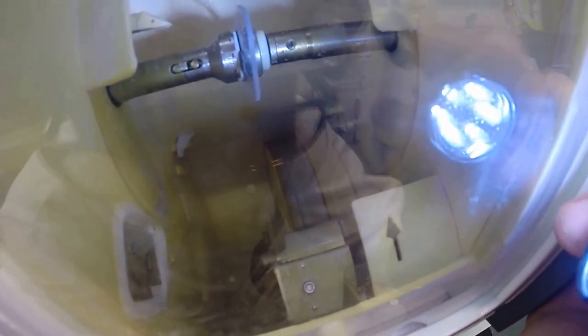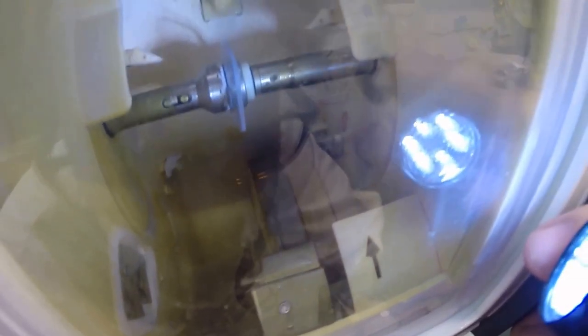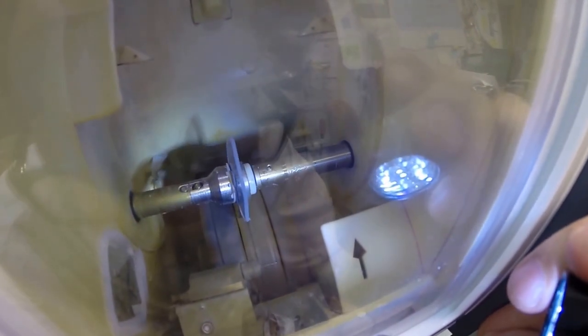Now, if you notice, your lens is completely flat around the edges, just like a nickel. If I were to take it out now, it would stand up on the counter on its own. In just a moment, it's going to drop down and have the knife-like edge, the bevel, applied to the lens. Now, it did trace the lens again, just double checking. The old carpenter saying: measure twice, cut once. It just wants to verify all the measurements that it took originally. Now it's going to drop down onto the bevel wheel.